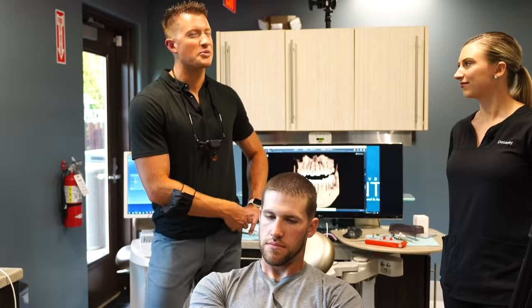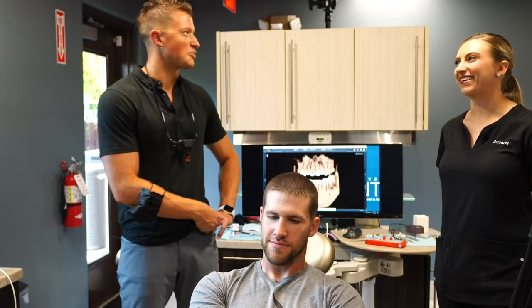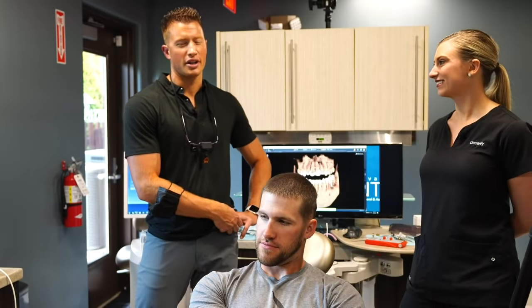And one thing that's amazing is like right now, I guarantee not bleeding at all. So the gums, they kind of cover up and stop bleeding pretty quickly. No, as you saw, no sutures were necessary, so we didn't have to do any of that. His chance of post-op infection is really low. He's going to take an antibiotic for 7 to 10 days here, and we'll see him in 10 days and just kind of make a verification. I'm pretty sure Dez would probably give me a heads up if he's complaining of that. So, yeah, and he'll probably get a phone call from me tomorrow and checking up on him, make sure he's all right. So, just like his mom.